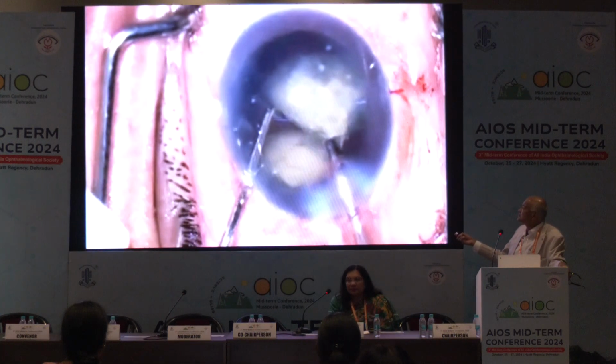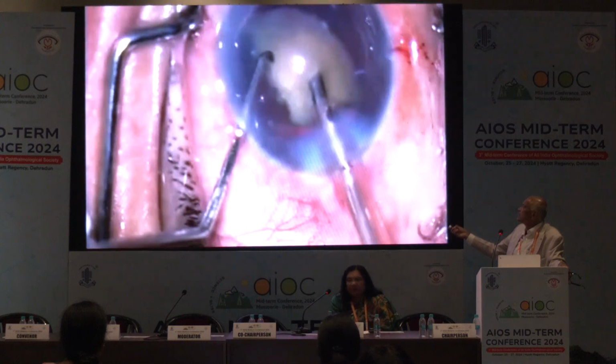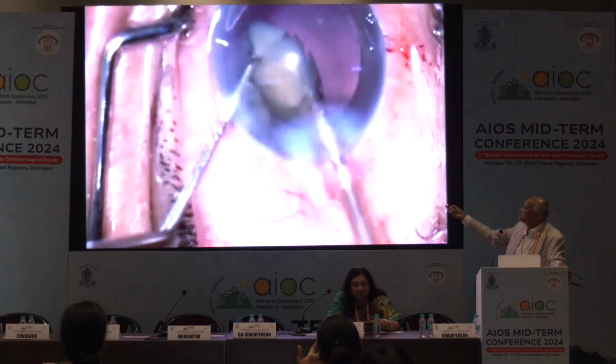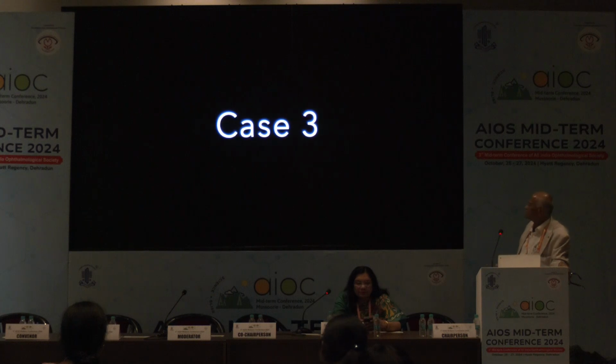So again, the small pieces I am making, and then, see here, always remember when the last piece comes, here you see, stand still. So it means here my chopper movements are reduced, and only slightly I remove this and take it.